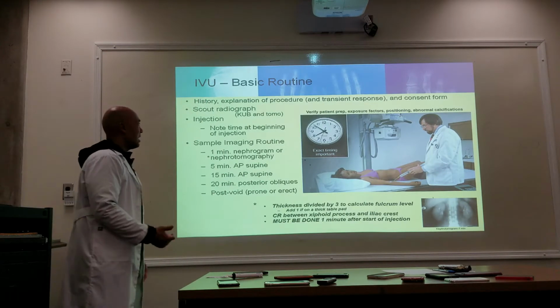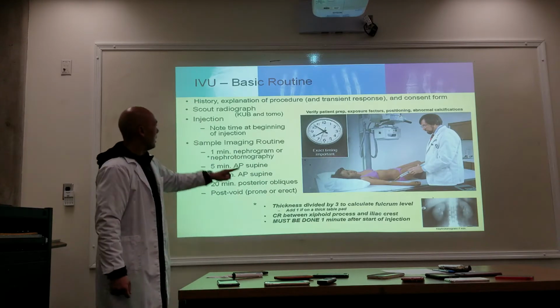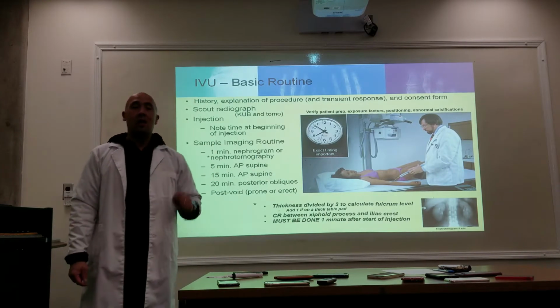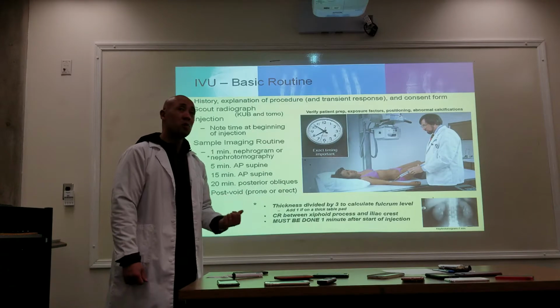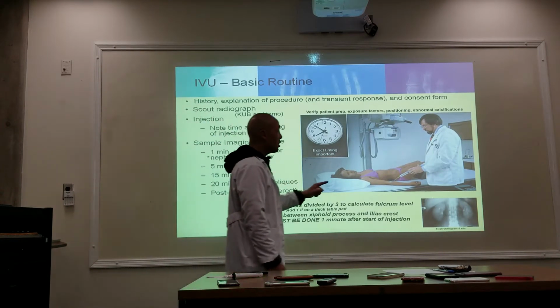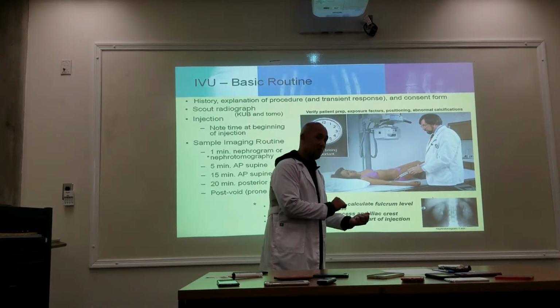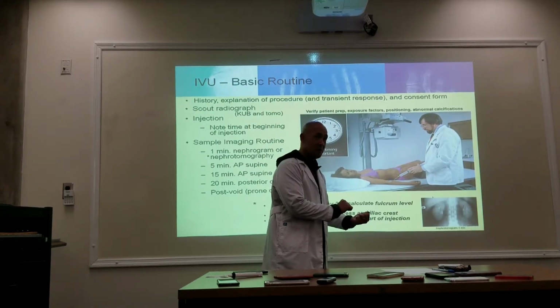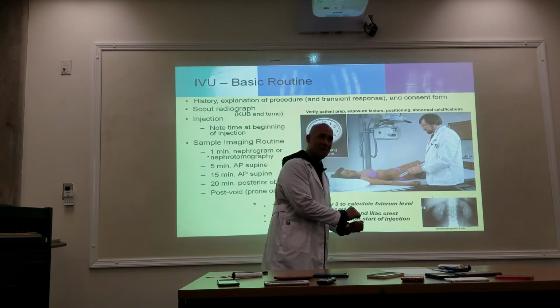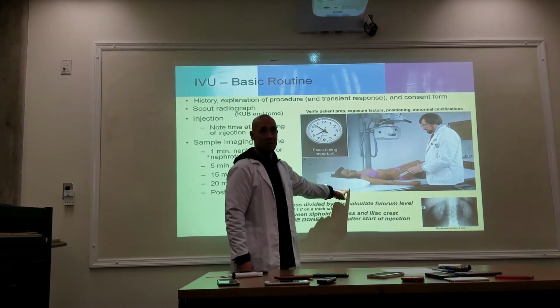Okay? As you're injecting the contrast material, note the time when you started injecting. Also, as you're injecting, you're not doing it fast. You're doing it slow because you want to make sure everything is okay. How are you feeling? You doing okay? Okay, good. Well, hang tight. I've almost got the contrast in. How you doing? You still doing okay? Good. How about now? You're constantly checking up on them, okay?